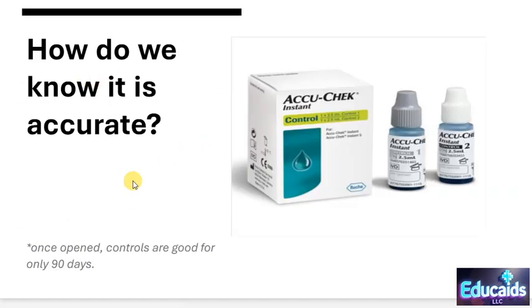So how do we know if our reading is accurate? In the hospital, every 24 hours, our machines require us, no matter the brand, Accu-Check, One Touch, McKesson, etc., to do controls. So it's as if we're doing a blood sugar, but we're using what I like to call fake sugar in the little bottle. And we're going to run that test and make sure that the meter is running it correctly.